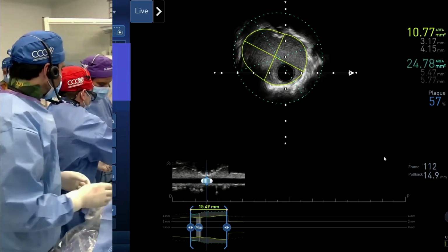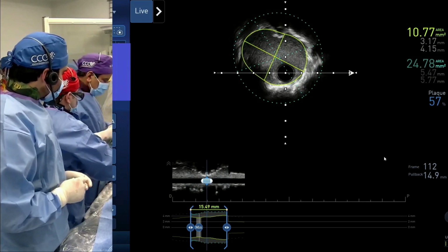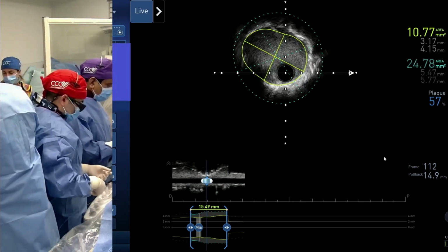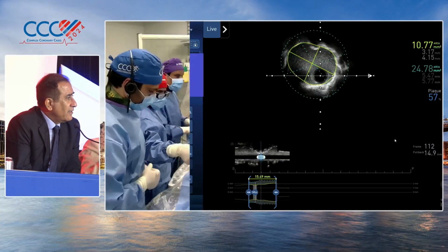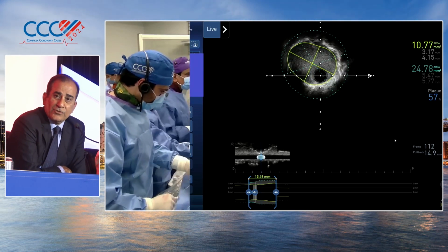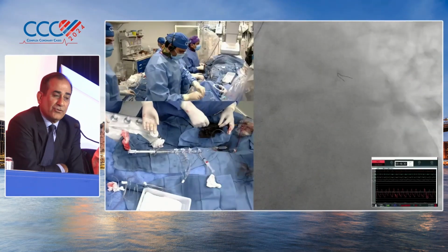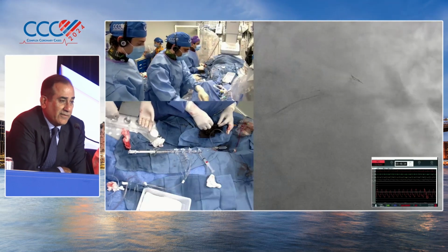Dr. Mehta has a question, real quick. Samin, quick question for you. The reason for you not to have put in the Impella here was because the EF was good? No, not the patient's body habitus. Okay, and the second, I think the real teaching in this case, which you went so fast, was how carefully the 2.0 burr was used. It was back and forth so easily, but it kept sticking in the inferior part of the left main.